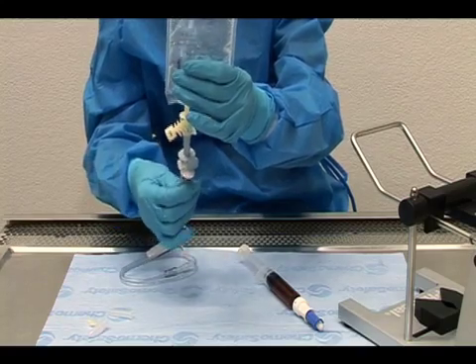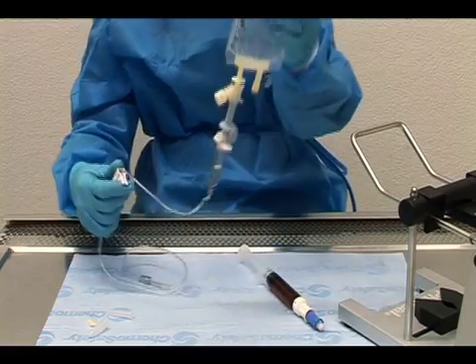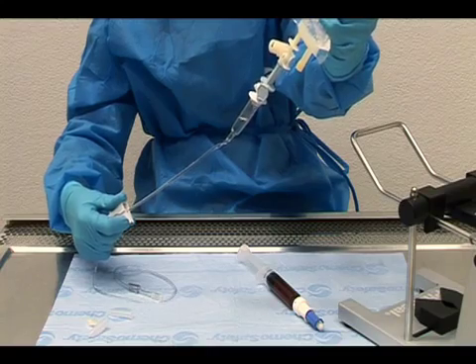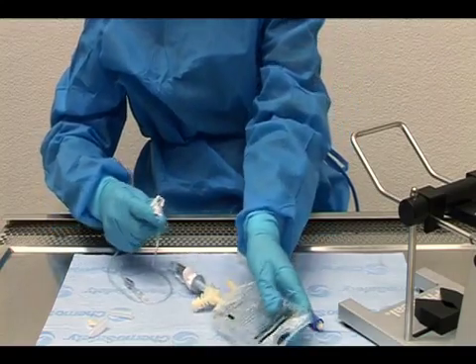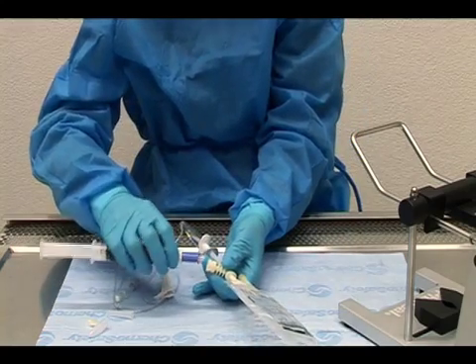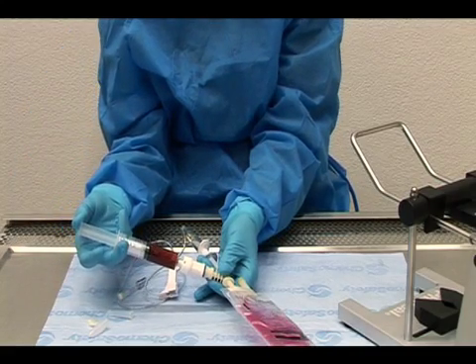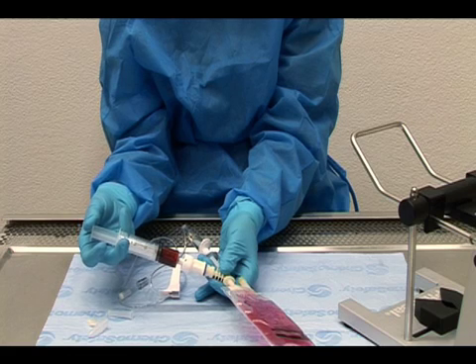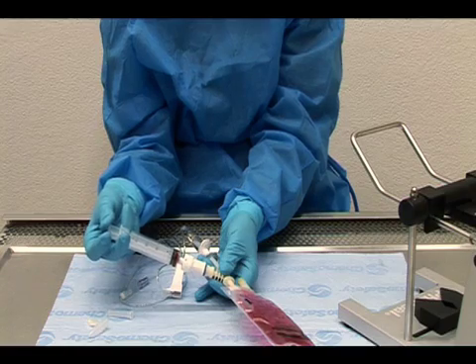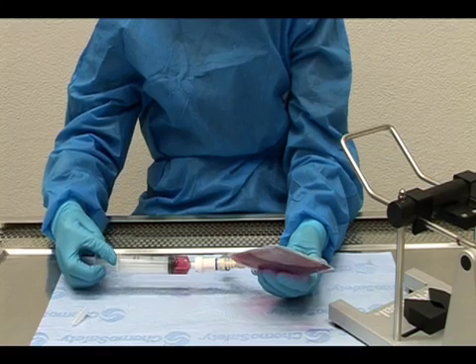Prime the administration set. Connect the drug's syringe assembly to the infusion adapter and inject the drug into the IV bag. Pull back on the plunger 20 cc's of diluted drug and flush the adapter port.